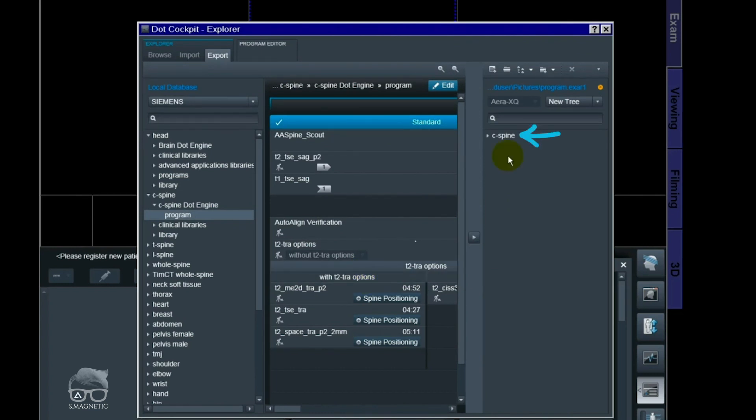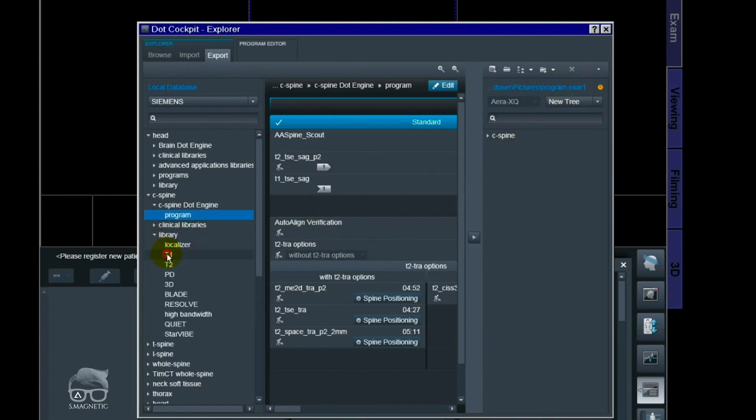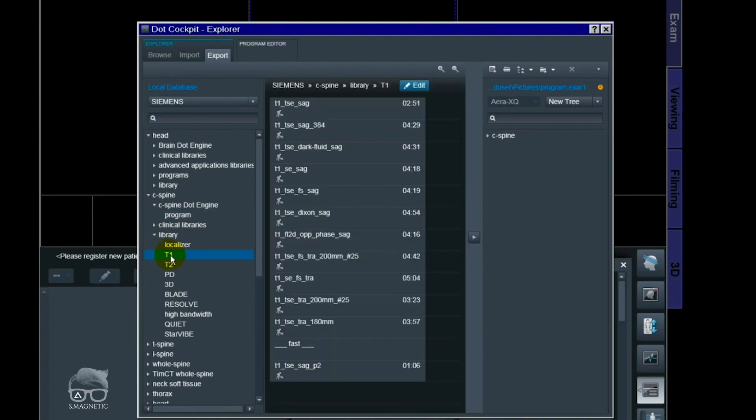So you see right there, I just saved the C-spine program. And in that saving file, I can add different protocols just like this one. Let me just add it like that. So I can add multiple, as many as I want.